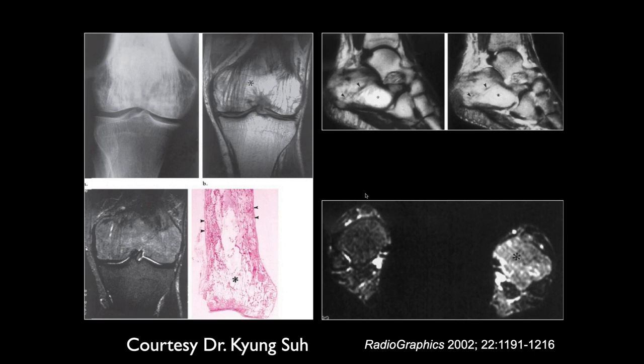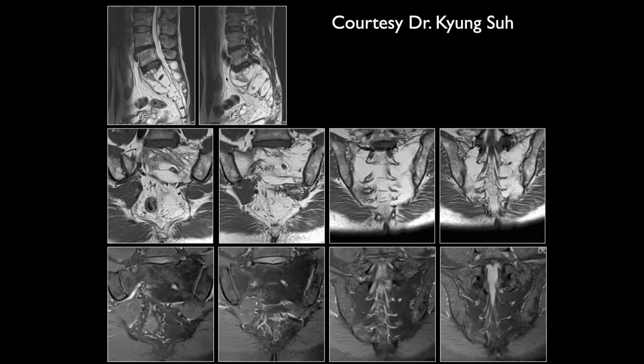And so on this, similarly, we've got some striations. Again, you're seeing that thickened trabecular areas, thickening of the cortical bone, kind of disruption of the normal architecture of the bone.